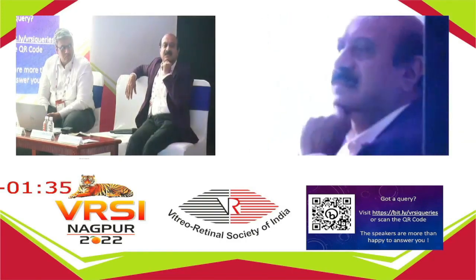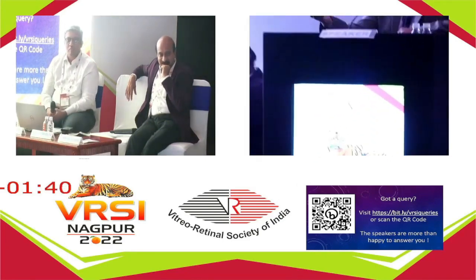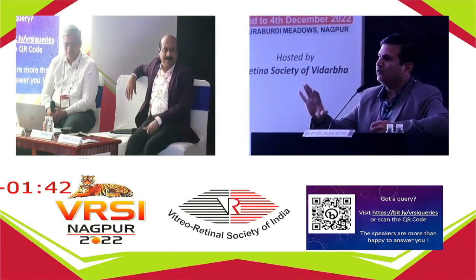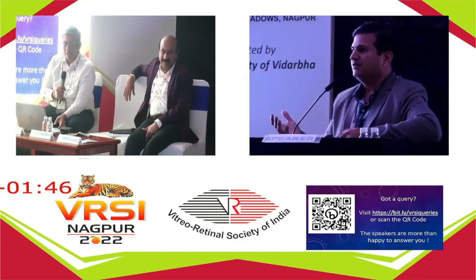Resolution has nothing to do with laser versus LED flash. It is basically the principle of photography. You can ask even a normal camera person, he will tell you, yes, the smaller the size, the better the resolution. It is always inversely proportional. Very true. So, very physics for you.